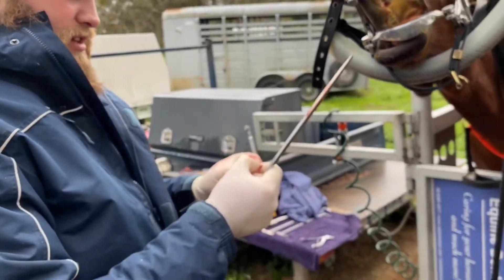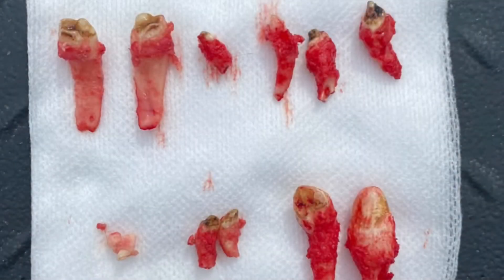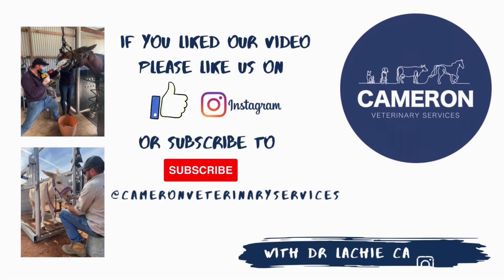They are honestly the biggest set of wolf teeth I've ever pulled out. This here shows you the difference in wolf teeth we can get in some of our patients. You can see those large ones pulled out in this video in the bottom right-hand corner, alongside a variety of different sizes. Not every horse is the same — some have huge roots, some have small roots, some we've fractured and gotten remnants out, and some have been on the bottom arcade instead of just the top. So it's very important to have a good look, be very delicate when removing them, and try to get the entire tooth out.